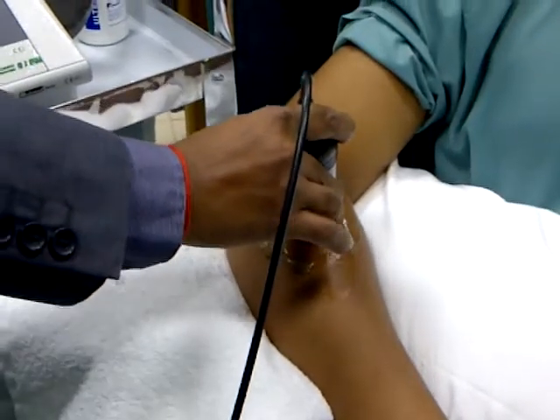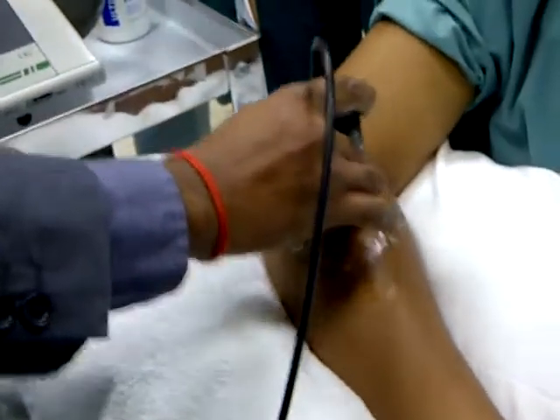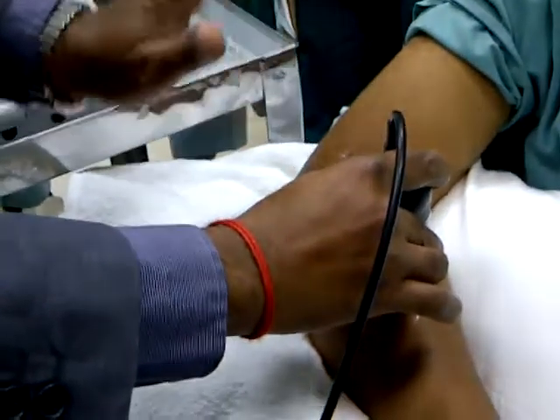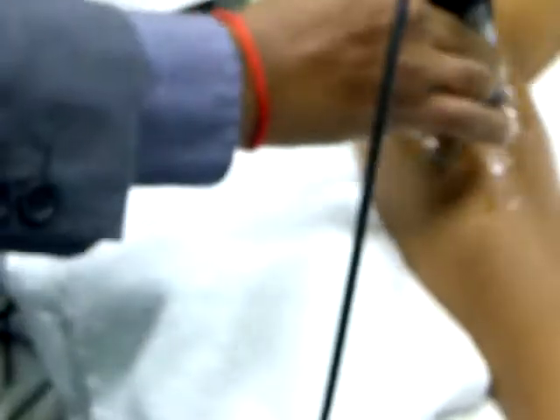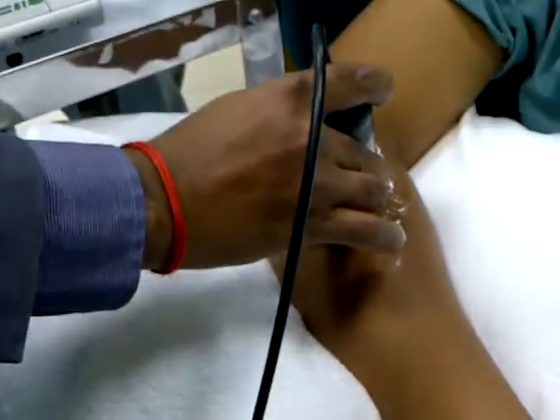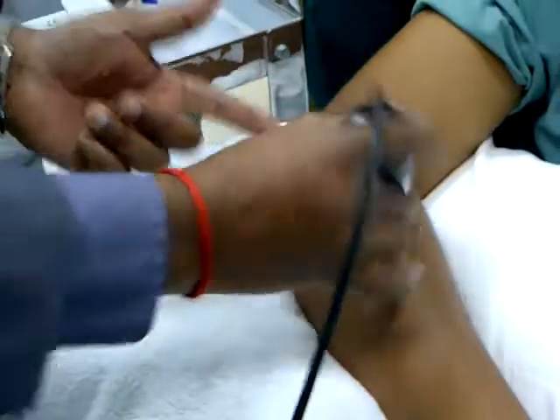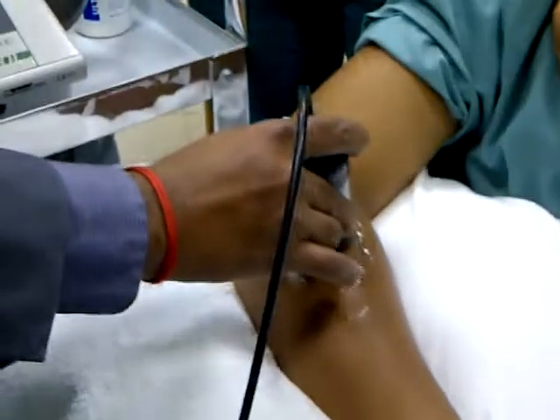See the properties of gel. Listen, when you are dealing with this, its consistency is still good. No running off, so that shows it is a good conducting medium. So all the energy produced here goes inside. If it runs off as water, then it is not a good conducting medium, and penetration or transmission of ultrasound is less. Also, no stain, and it will not rust your metal plate. No carbon, no metal. So those are the properties of gel.